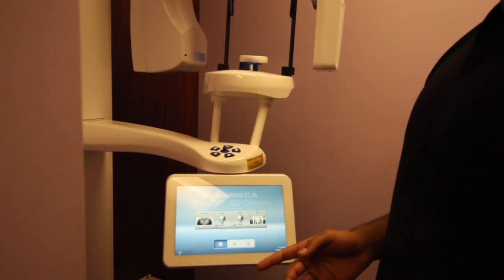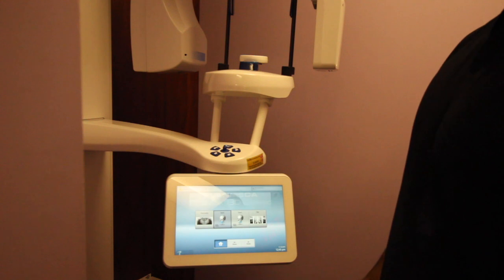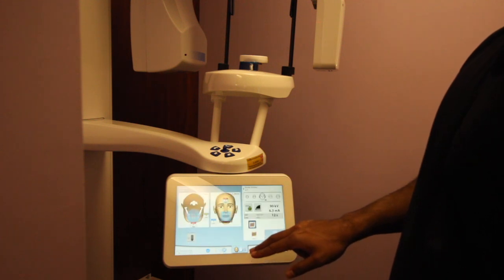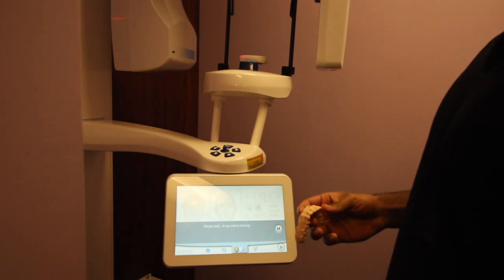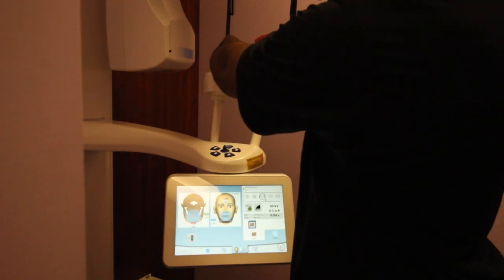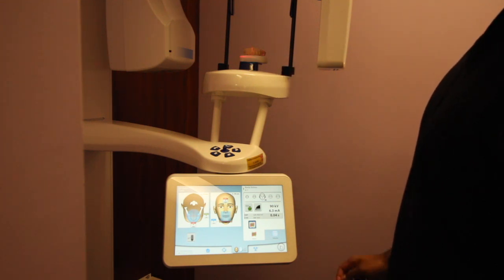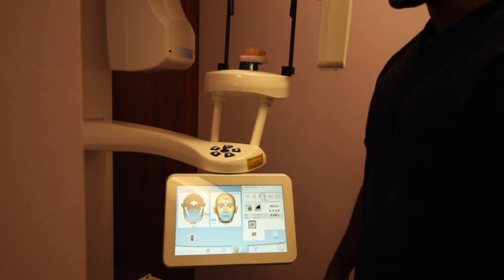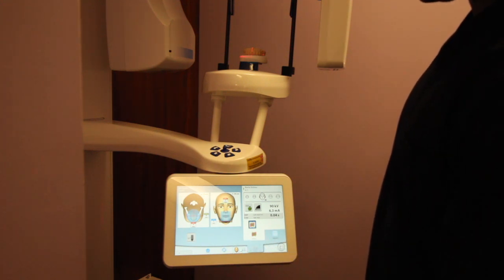So now we're going to go to our ProMax 3D Classic here to scan it in. We're going to go to 3D teeth, this option right here. The settings look pretty good here, so we're going to move over to here so it adjusts a little bit. Now I'm going to put the model into the machine, and we're going to make sure that the red line is going through the midline of the model, just so it's aligned properly and we can calibrate properly in Mesh Mixer. So then everything's set here, so now we're just going to step out and scan it in.